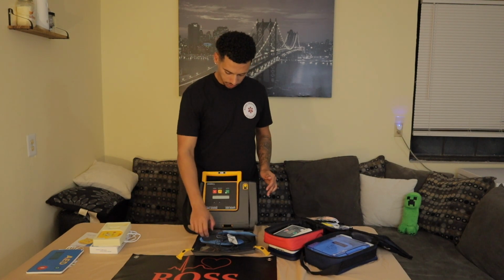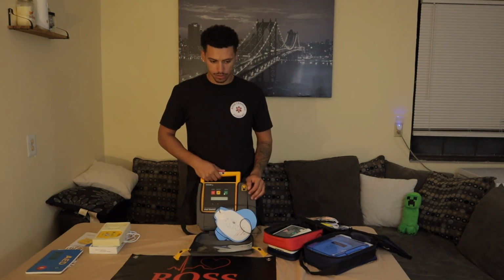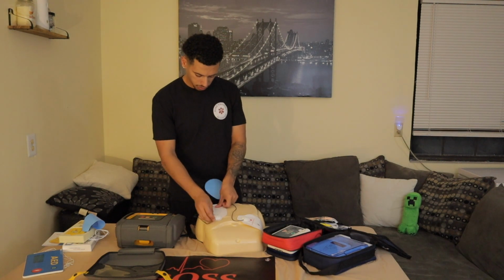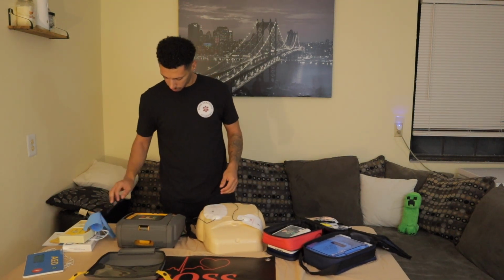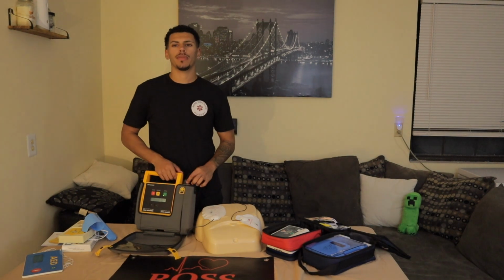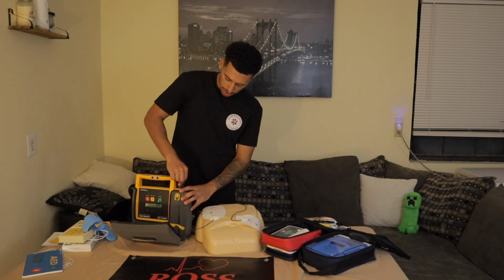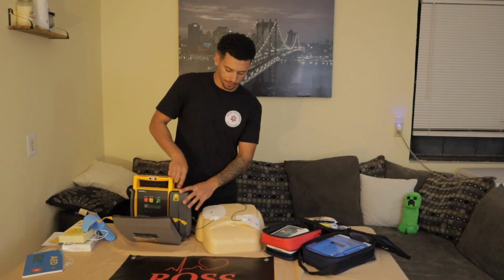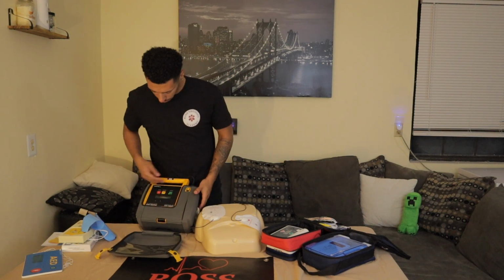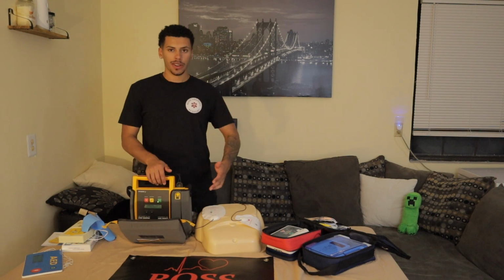Connect electrodes. Yeah, they're on. Connect electrodes. Huh. Well, I'm not sure what's going on, but I can't get past the connect electrodes prompt. Those are all plugged in there. I thought these might have to be on. Not really doing anything else, but it still just says connect electrodes. So, we're going to go ahead and move on from this one.